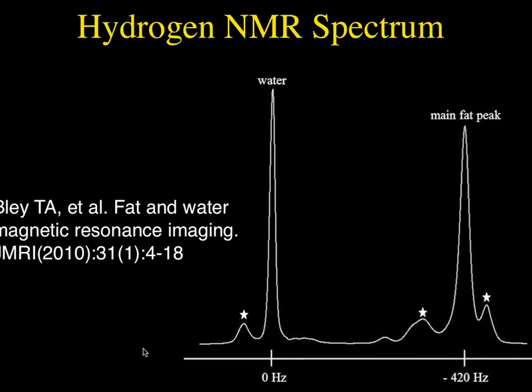Most of these hinge upon the fact that water and fat resonate at two different frequencies. In fact, at 3T, as we know, there is a 420 hertz difference between the main fat peak and the main water peak, which we see here.